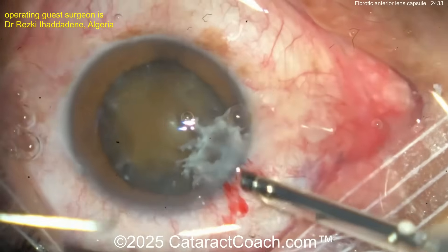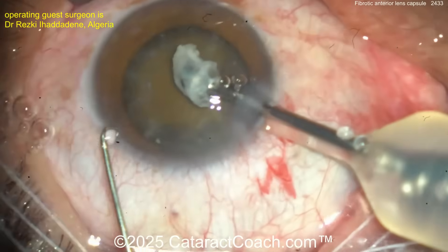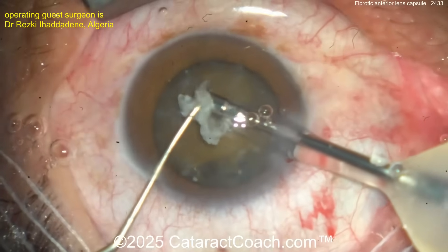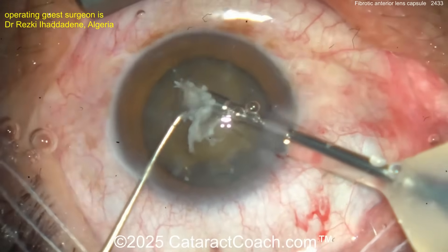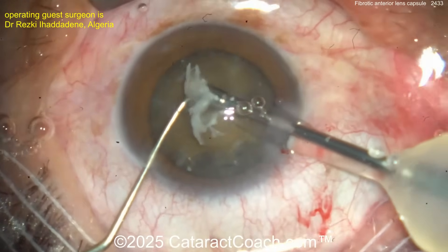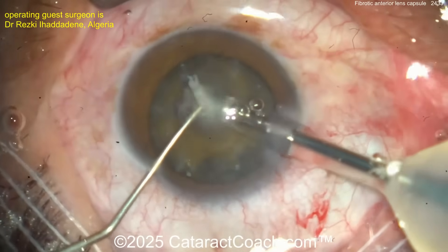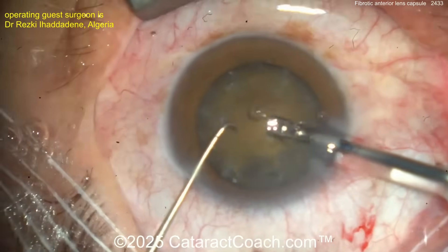I wouldn't even ask for the phaco probe — I'd just pull it out with forceps. But okay, you're going to use the phaco probe — whatever you like, you teach me! Buzz into that big gooey thing. Sometimes it may clog up your tip or won't break up with ultrasound — that's why I would have just grabbed it with forceps and yanked it out. But okay, it's gone.